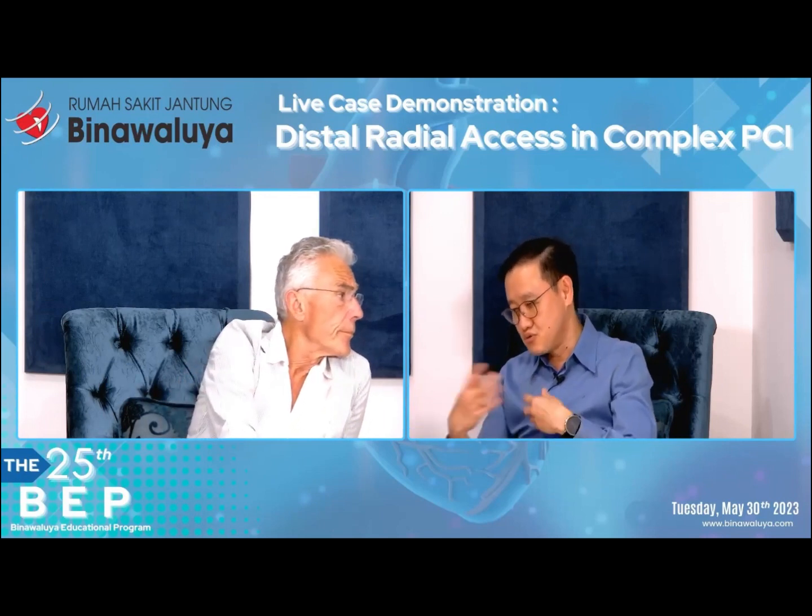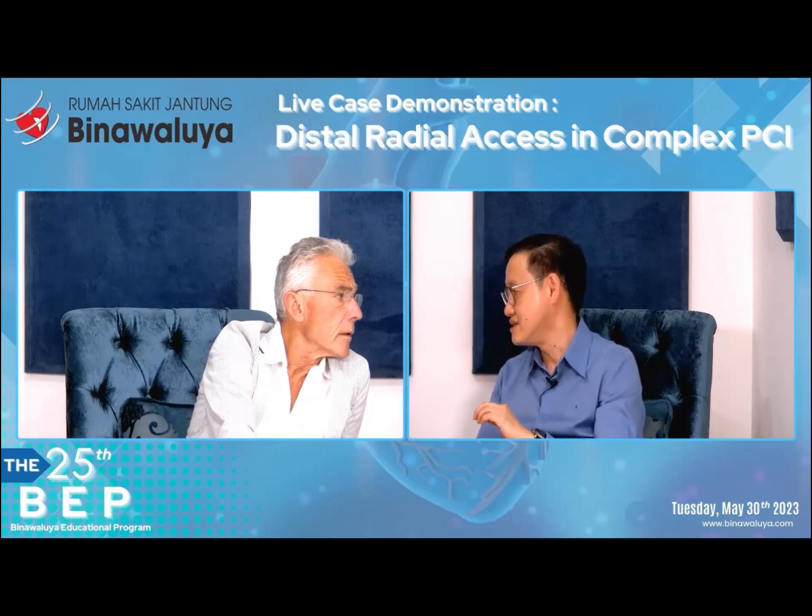Okay, thank you. So there is a question from the floor. Usually we puncture the distal radial for angiography, and then afterward we don't do PCI directly because it's a complex case we discuss with the patient. So tomorrow, whether we can use this site again for the repuncture, and how many times we can repuncture in the same site? Yeah, well, of course, that depends how the first time went.